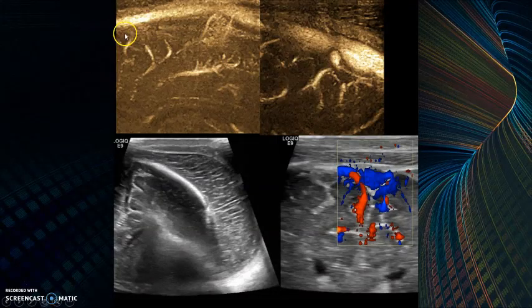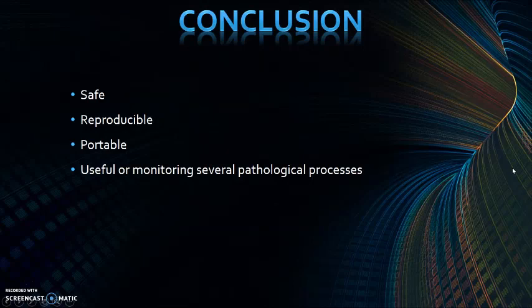It just turned out to be that the flow was very slow. This is B flow. You can see flow within the vein right here, and this is with regular color. Adding slight pressure to the fontanelle would increase the flow, and you would see the flow. So that was a false positive. And here you see the edema on the scalp of this baby. That was on ECMO, or extracorporeal membrane oxygenation, for respiratory failure.